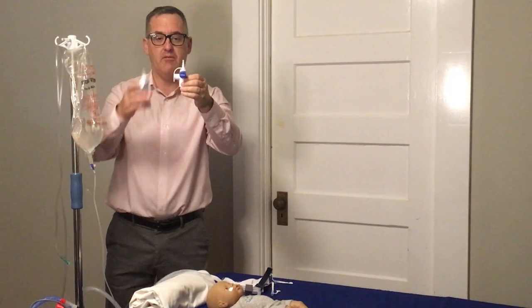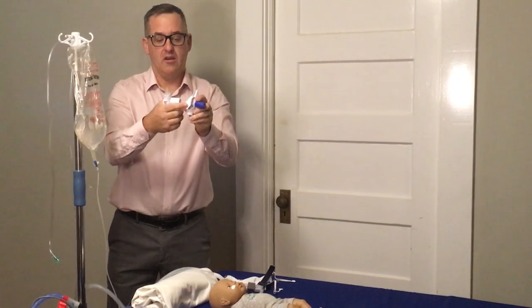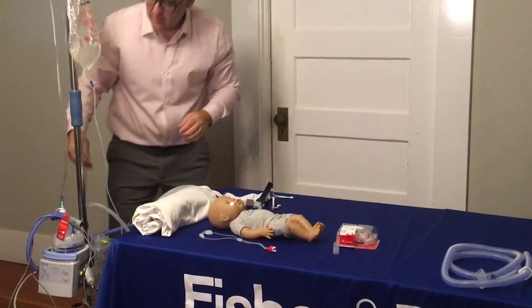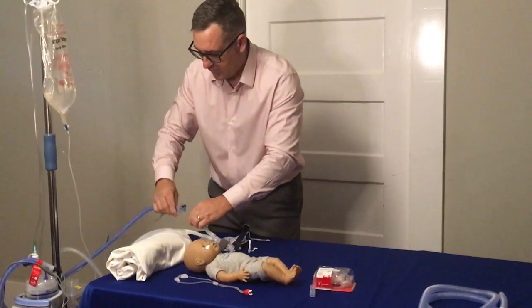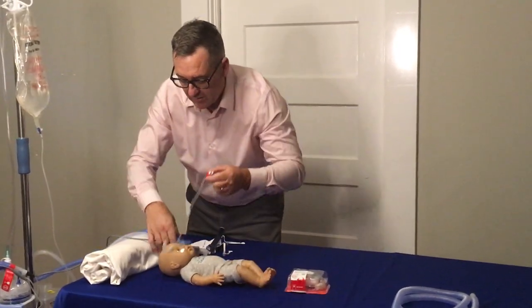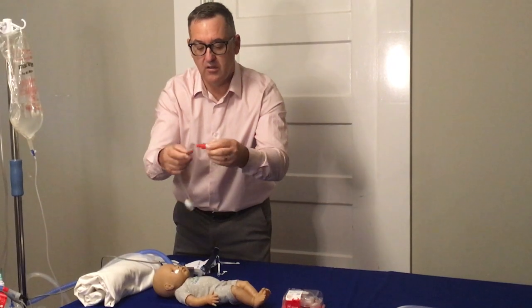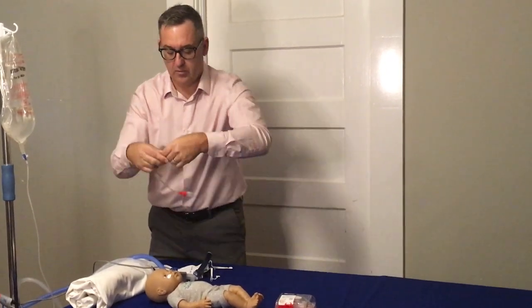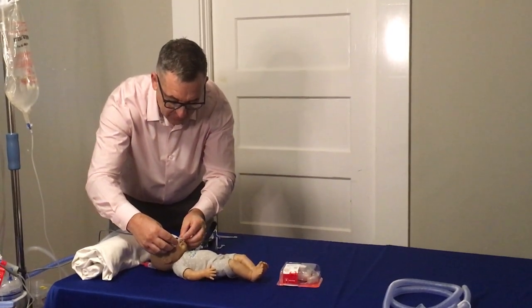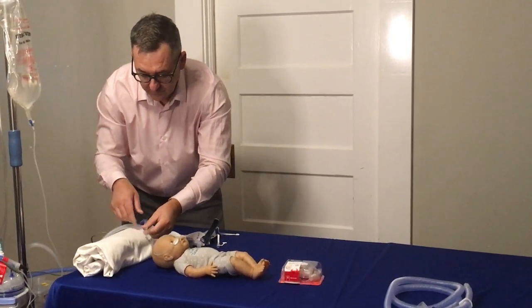I do like this new high flow pop-off — it looks considerably different from the bubble CPAP pop-off, so it's a lot easier to remember. There is also the O2 analyzer on the side. We're going to put in the new pop-off, plug in the O2 tubing, take the inspiratory limb away from the interface, and then plug in. If you look at this adapter, it just connects at the end of the O2 cannula. We fix the O2 cannula into the baby, making sure we have it exactly the way we want it, plug it in, and voila.